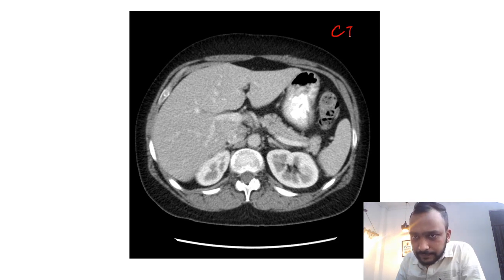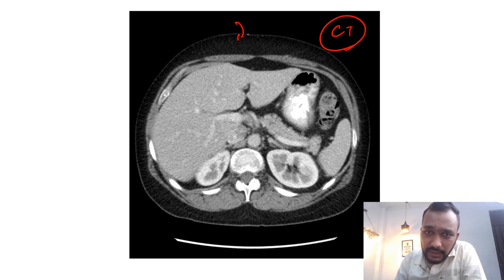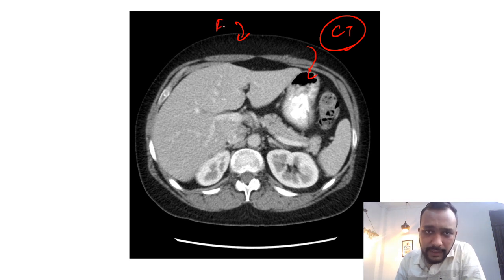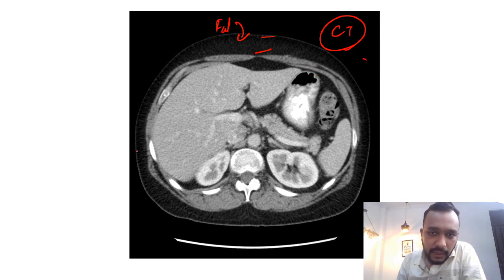Just remember there are two things which appear black on CT: one is your fat and the other is air. This is your subcutaneous fat which is appearing black, and the other is air which also appears black on CT.